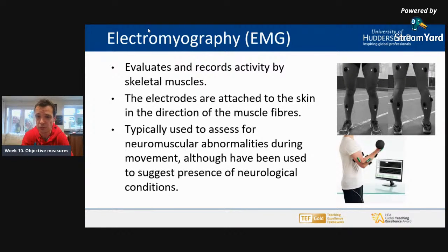These are improving all the time, and the more recent ones now have things like accelerometers in them as well, so it can tell you actually the rate of acceleration of a joint and deceleration, things like that, which is really quite useful for advanced sort of analysis, really. But as you can see, really portable. The vast majority are wireless now. You don't get many wired ones coming out, so you can use them and get your patient to do lots of functional movement.